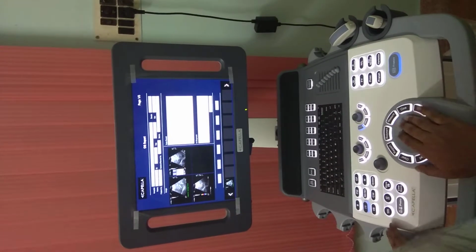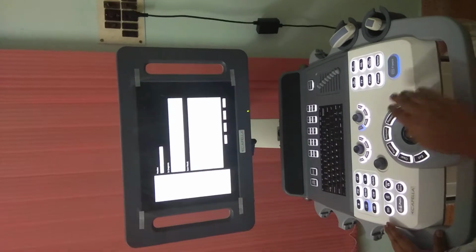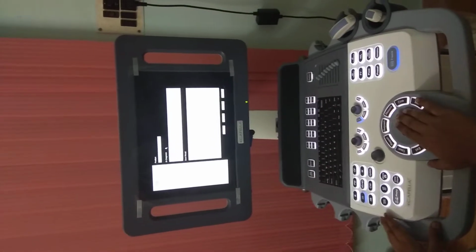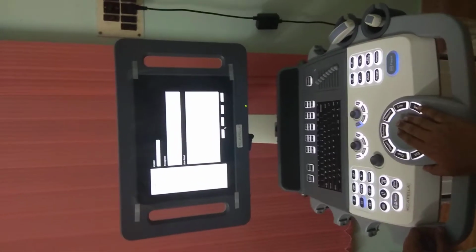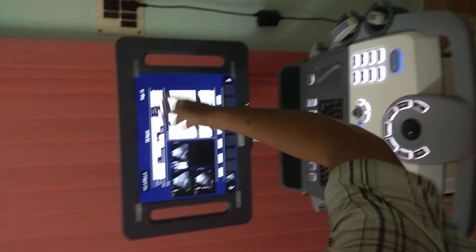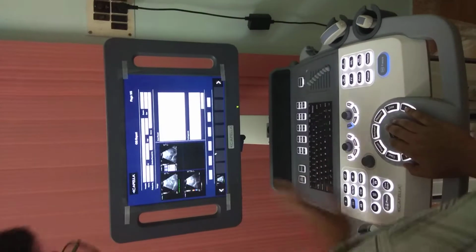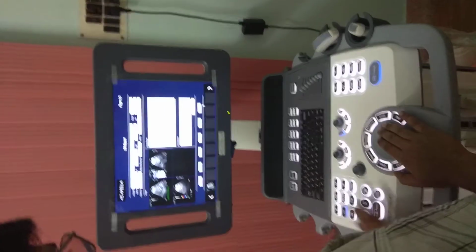So just like this. And you can also add diagnosis module. For example, we have added one demo module over here, so we can just select it, and you can see everything will come up. Press select, the module will come over here. Okay, so now this is our report, and this is the first page, as you can see, 1 out of 3.